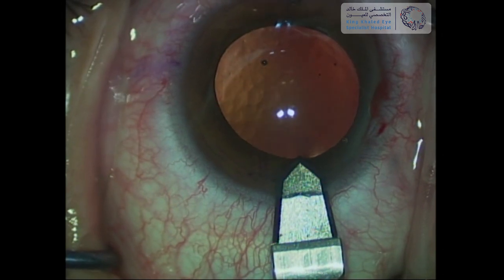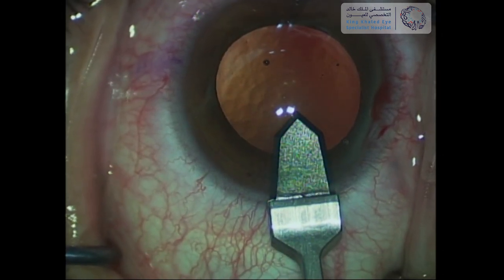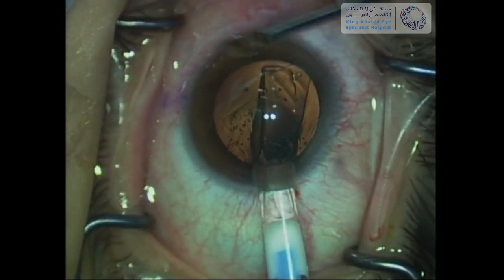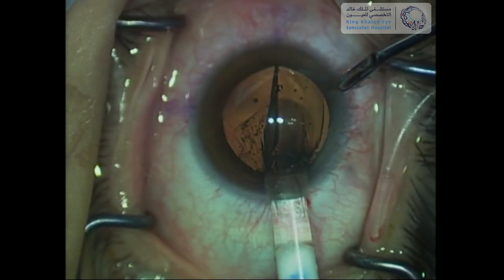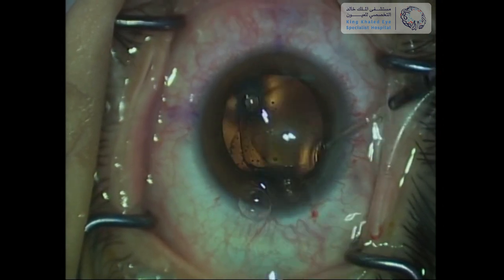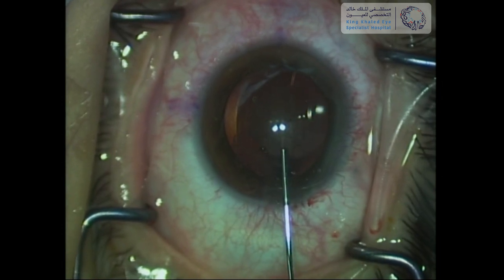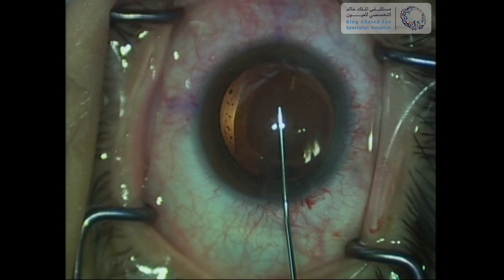The main corneal wound is then created temporarily with a diamond blade. The ICL is then injected into the anterior chamber gently, with the bevel of the cartridge aiming downward. After that, a small amount of viscoelastic material is injected above the ICL to protect the corneal endothelium.